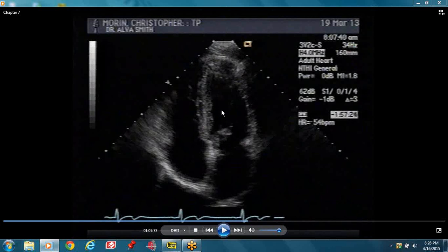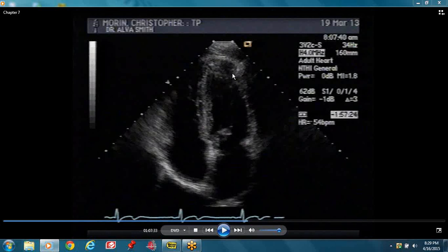The transducer is up there. This is your left ventricle, your left atrium, your mitral valve — this is the anterior leaflet and the posterior leaflet. Interventricular septum, interatrial septum. This is your RV and this is your RA. In the apical four chamber view: this is the lateral wall — basal lateral, mid lateral wall, and apical lateral wall. This is the septum — apical septum, mid septum, and basal septum.